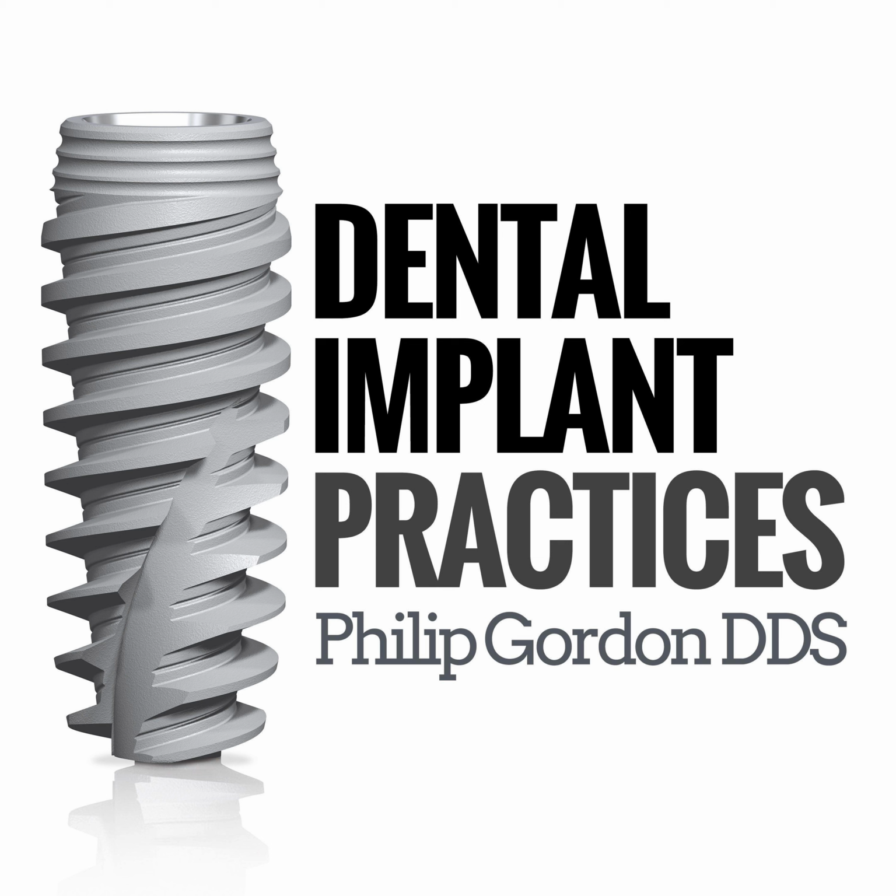Because sometimes centric relation and centric occlusion can be different. So we just want to make sure that we have all of our ducks in a row so that we don't mess up this patient's bite. So the scan, at least 13 centimeters if you can. Of course, if you can't do that much, get us the full arch that you're looking for and a little bit of the opposing, so we at least can align the models.